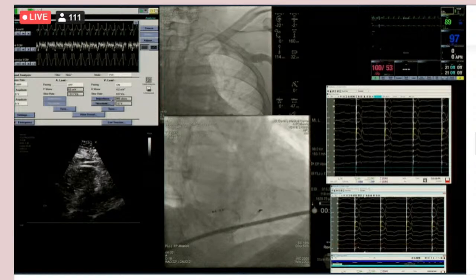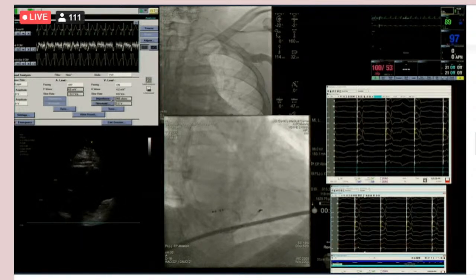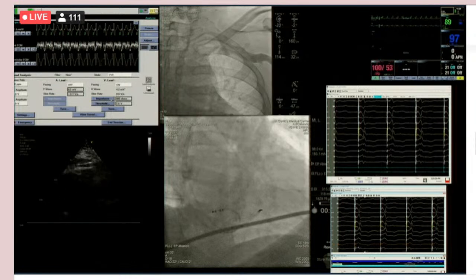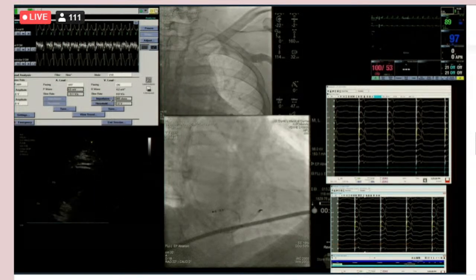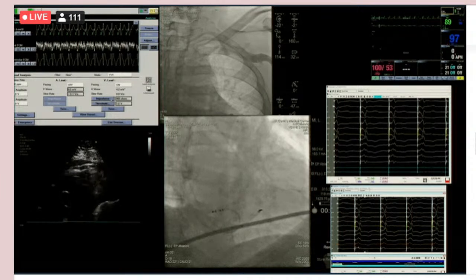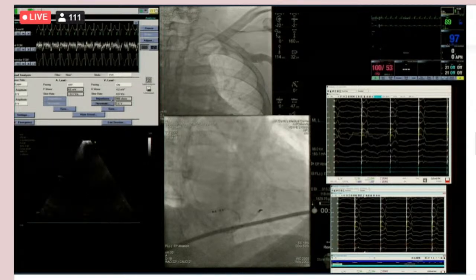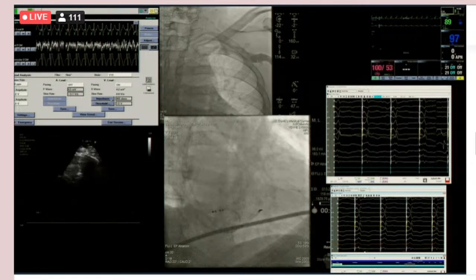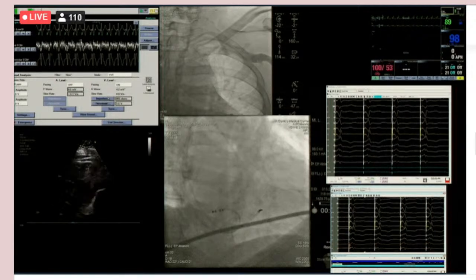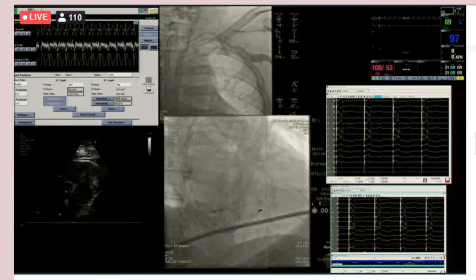So generally, I feel like there's a learning curve enough with this that if you do this and you don't quite get into the left bundle, what's the worst thing that can happen? Well, your lead's in the middle of the septum, not harmful. It's not perfect, but it gives you another go to practice with. So I think you can't perforate unless you go into the left ventricle, but you're not going to perforate into the pericardium. So I personally think that you have to devote time, because this is one of those things where you'll never get good at it otherwise. Then when you have a case that just depends on it, you won't be able to do it.